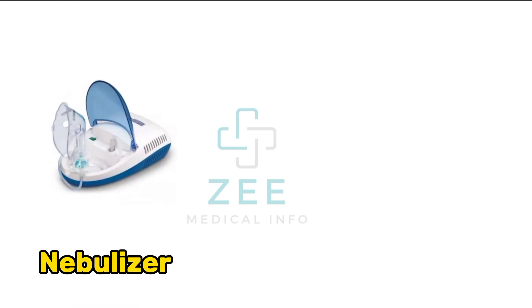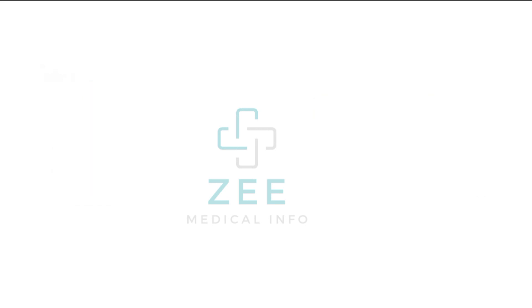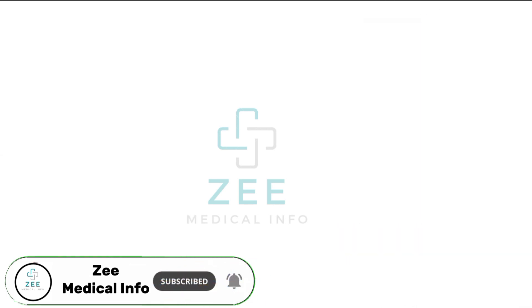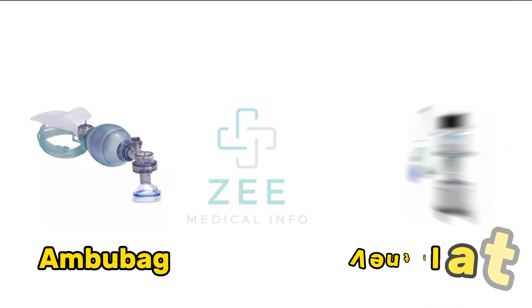Nebulizer, nebulizer solutions, weight scale, height scale, ambu bag, ventilator.